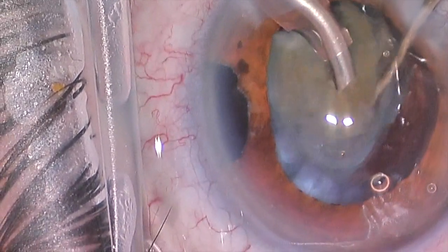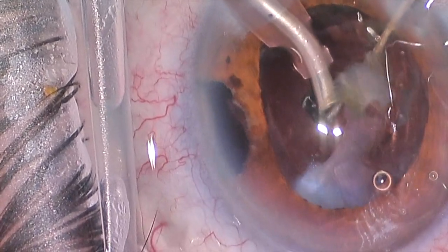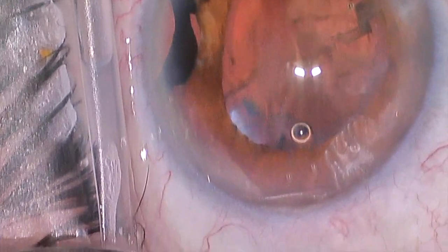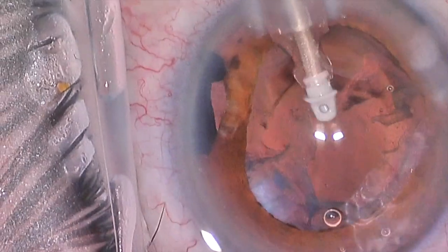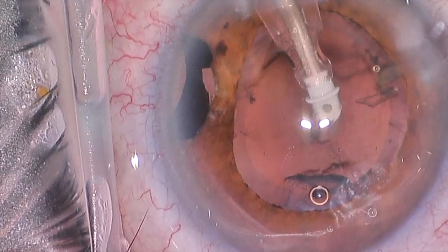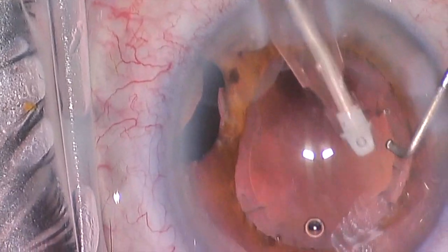These more dense cataracts take a lot of patience. It's really nice when the lens breaks up very quickly into numerous small pieces and is vacuumed out, but the denser lenses take more time. The techniques are the same — you just have to be more patient. Now we've got a large majority of that lens removed. There are still a few more central brittle pieces and probably a larger portion of peripheral cortical material remaining. We'll take now what we call an irrigation aspiration handpiece — it has a smaller opening and does a better job of just vacuuming lens material. It does not actually physically break up the lens material itself and does not have any ultrasound.